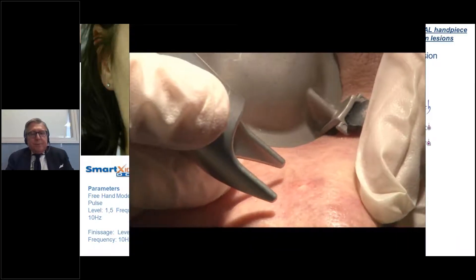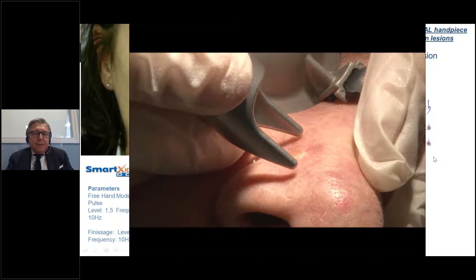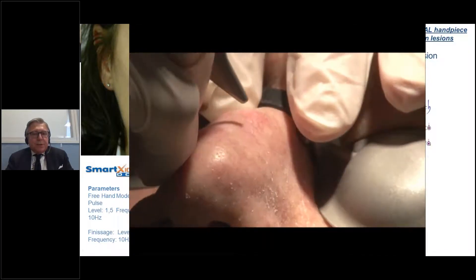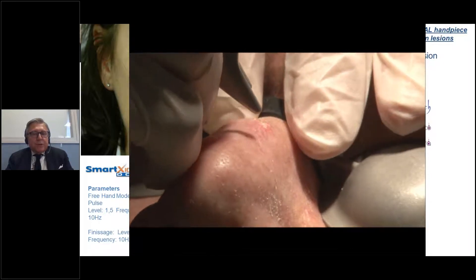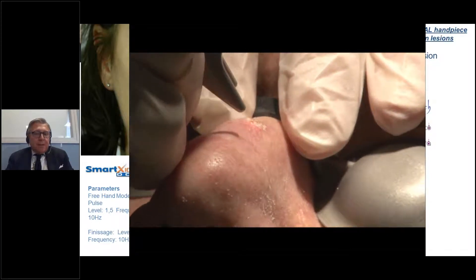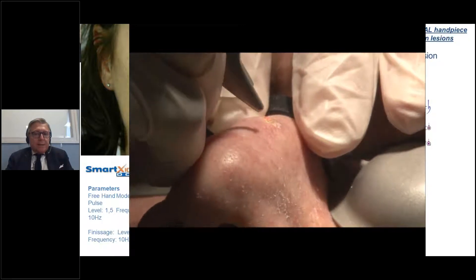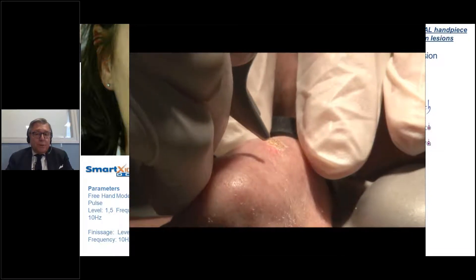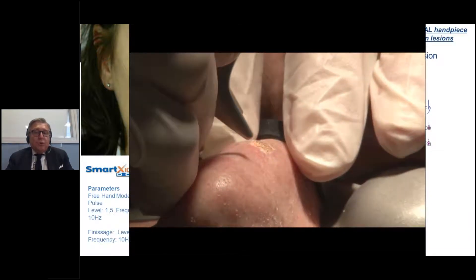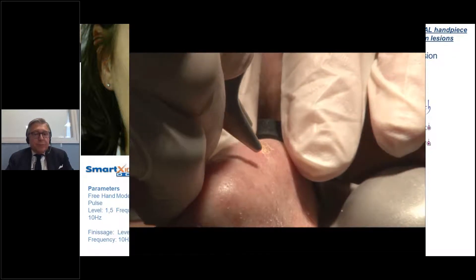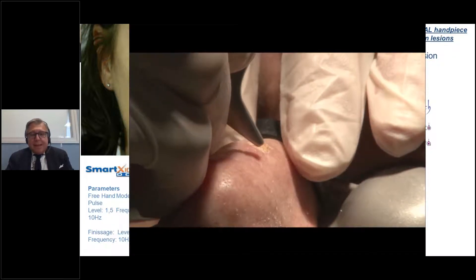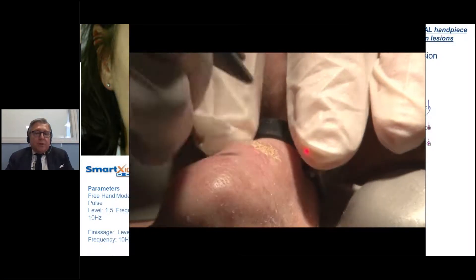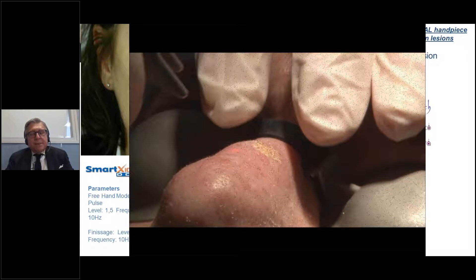In this video, the skin shows sun damage with some actinic keratosis. We vaporize very superficially using the SP pulse, making one pass and then removing the necrotic debris with wet gauzes — which is very important. You can see the capability to cover an area with some discoloration, hypochromia, and sun damage.